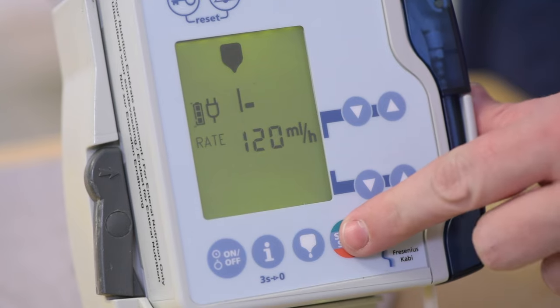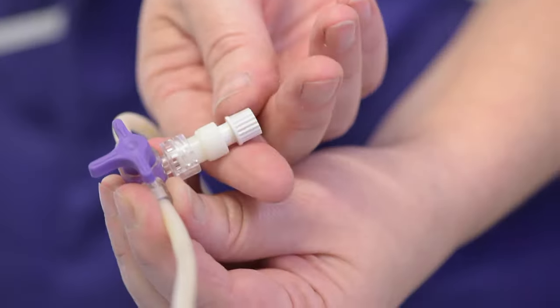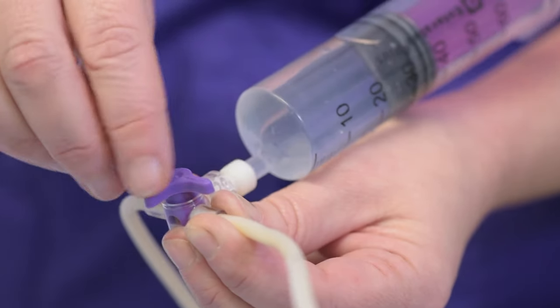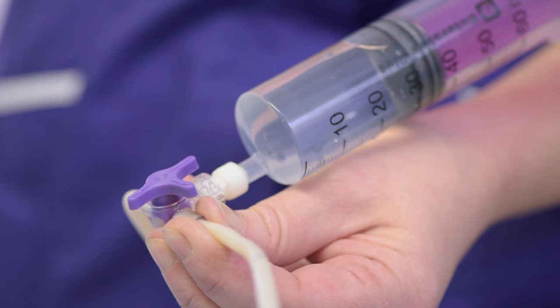If the feed is already in progress, stop it by pressing the stop button on the feed pump. Remove the end of the medicine port. Attach the syringe to the medicine port on the giving set. Turn the valve to open the port. Flush the tube with the recommended amount of cool, boiled water.